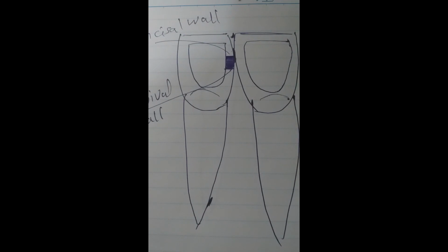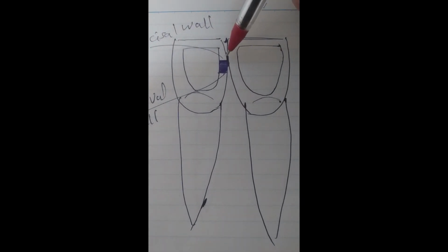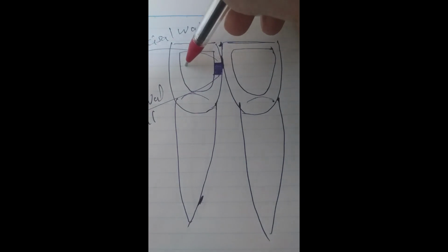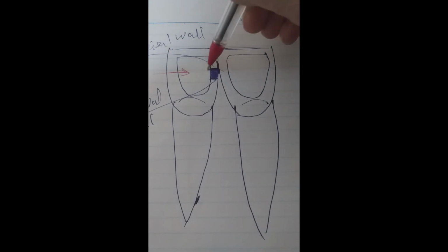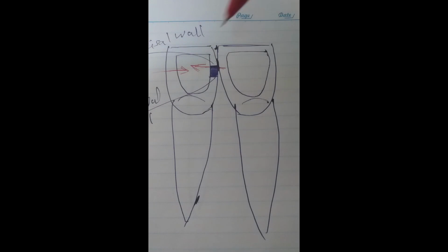One last point, the dimensions. From here mesially or from here distally, entering like this is called axial depth, or from here, this also axial depth.